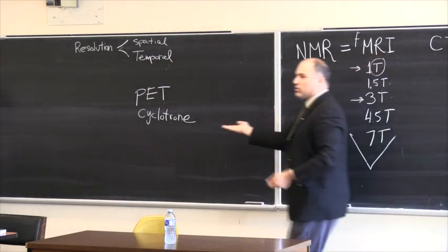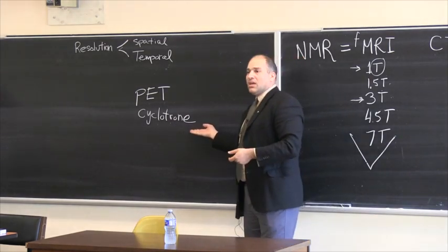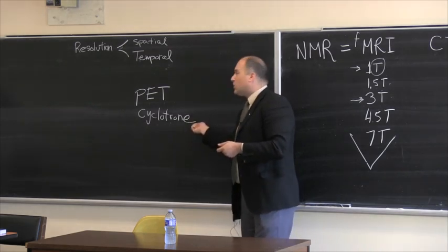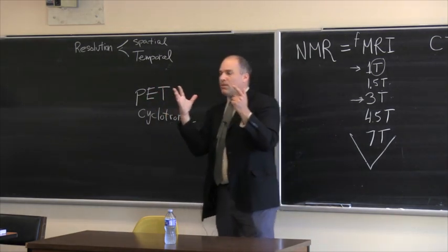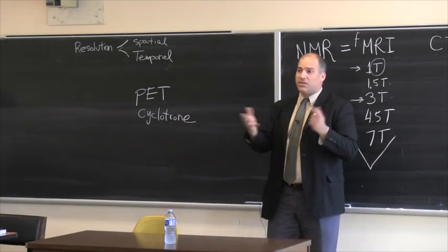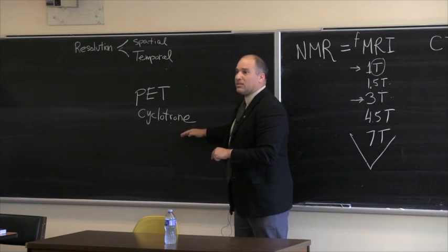We're trying to create it so that the person in the scanner has minimum exposure to radiation. We're trying to create radioactive materials that are very, very low radiation so that we can inject them. So we create them in such a minimum dose that when we inject them, we have just the trail end, and from that we can surmise what's going on. If we gave very strong things, we wouldn't need that. We could send people to Japan or other places and do these kinds of studies. Not nice.